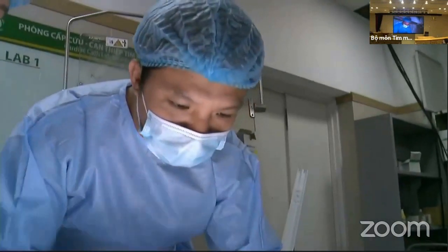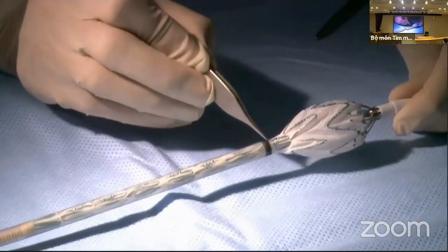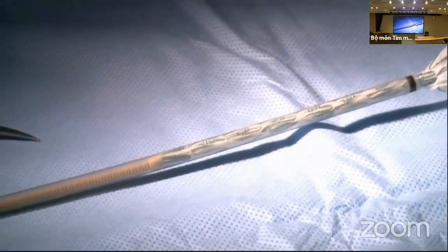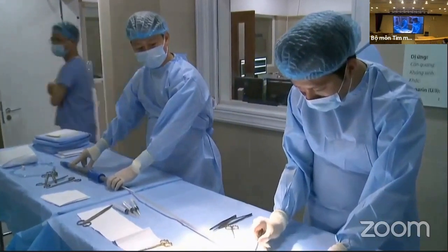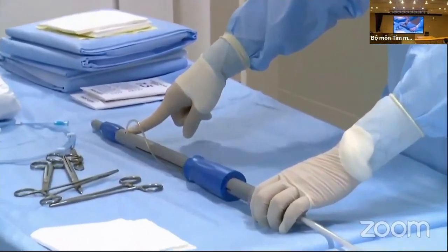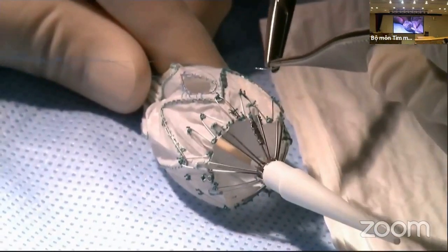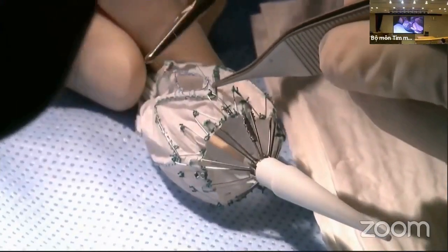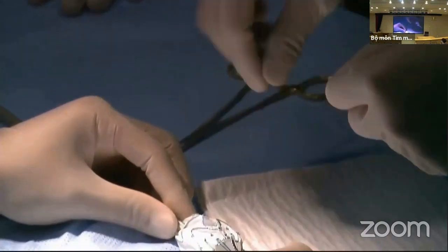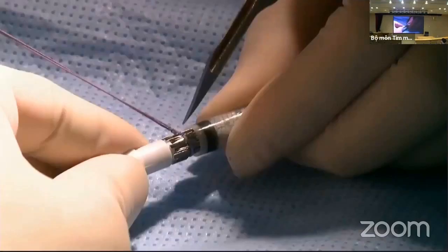So first of all, we have to release the three cells of the stent graft. And this is the important thing, that you have to determine where the marker is, based on the connection of the stent graft, very clearly when you see it under fluoroscopy. And then it's aligned with the arm side at the end of the delivery system. And then based on CT guide, after a very precise measurement, we make a hole, and then you can see here the suture. The hole here is also guided by CT, concomitant with the size of the left subclavian artery.